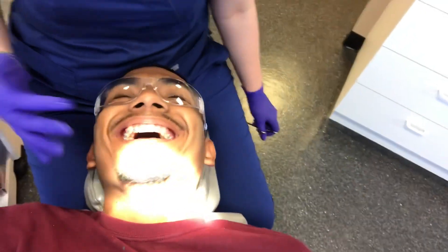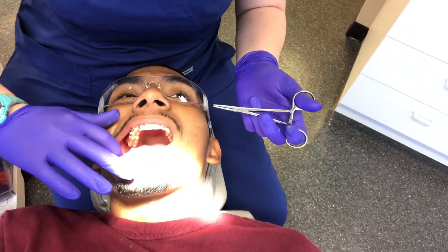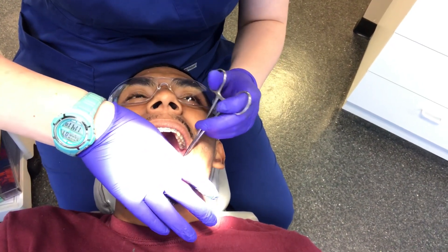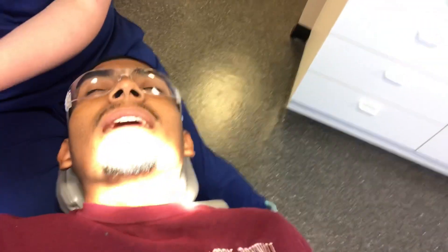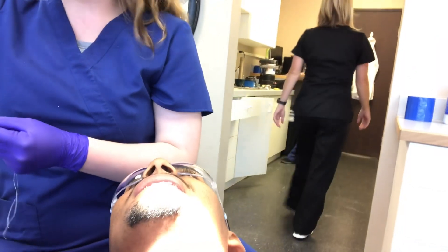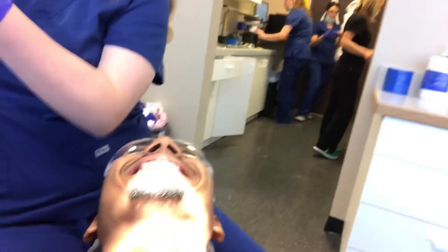Could I get metal on all of them? No, unfortunately. The metal ones we use just for when you have a filling, because when they do fillings they make it a really tight connection to your next tooth. If they don't, your filling could catch more food and you can get a worse cavity. How long is the pressure going to be there? Probably for today and tomorrow. After that you'll pretty much be home free — like when you got your braces, you were a little sore for a couple of days and then it went away.